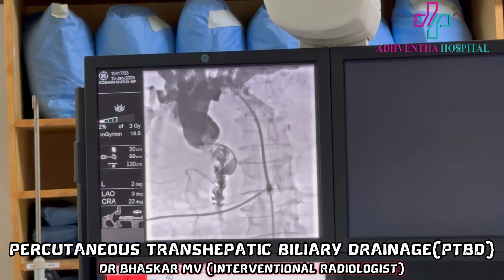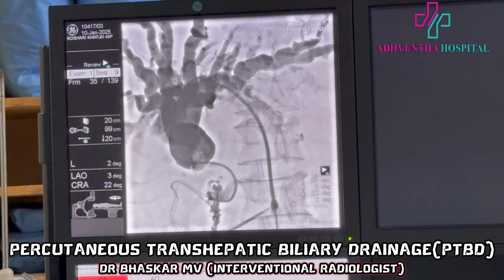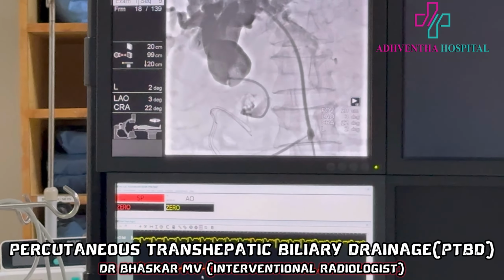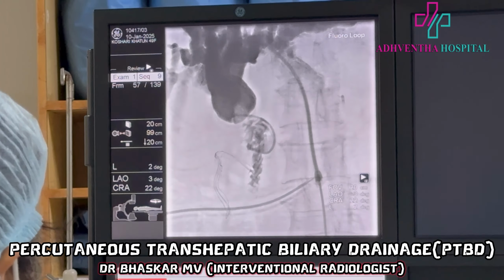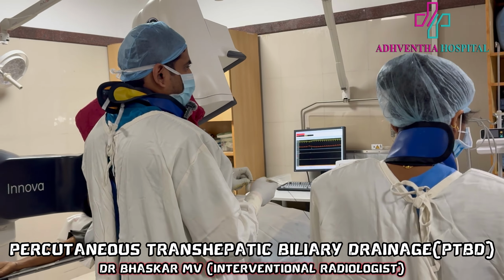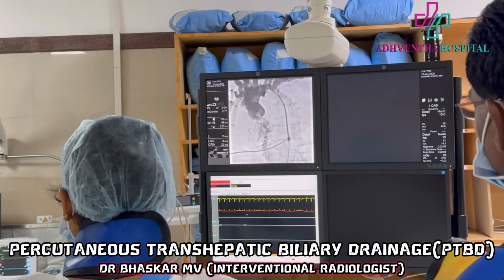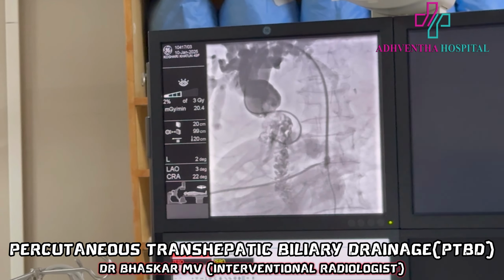That's a beauty. So now see that whatever fluffy things you are seeing, they're all plicae. There are multiple plicae within the duodenum. Give the wire again, the hydrophilic wire. Going. That path of the wire as well as the catheter you should be knowing. That is our aim. So this is easy to internalize. So once this goes into the duodenum, you can then move around easily. See that papilla it has crossed.